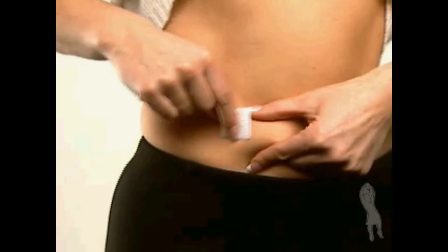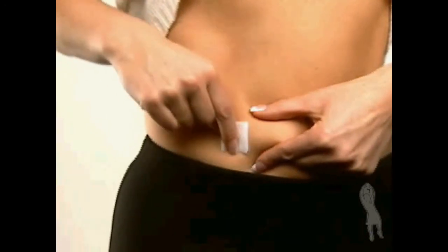Choose an injection site in the lower abdominal area, preferably around the belly button but at least one inch away. Take an alcohol wipe and clean the skin at the injection site and allow it to air dry.